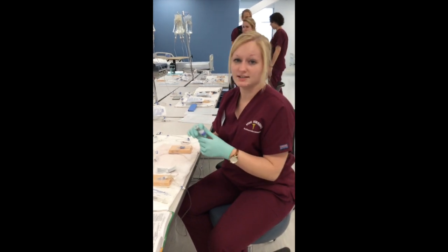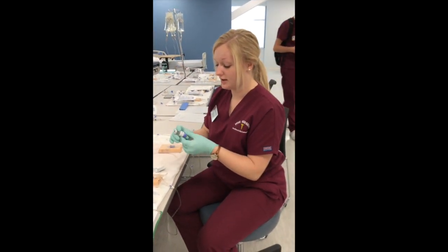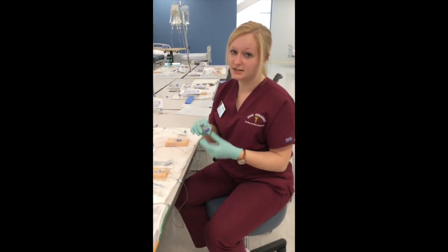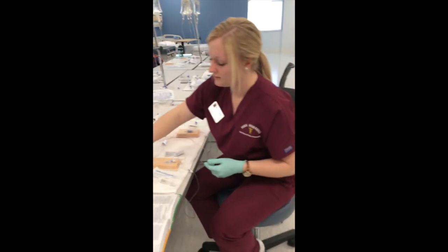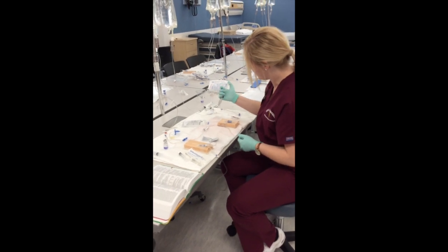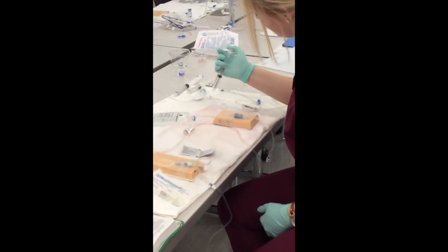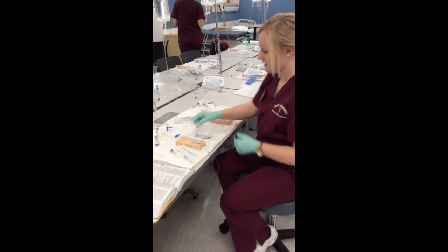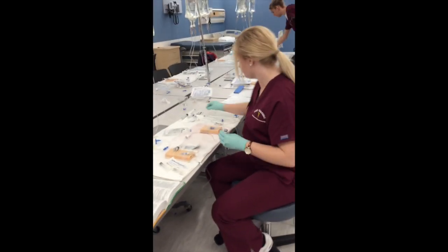I'm going to check all my 6 rights of medication administration. And I know I'm going to be drawing up 2 milligrams, and I noticed in my drug guide that it needs to be diluted, so I'm going to dilute it in 5 milliliters of normal saline. So I'm going to go ahead and get just 5 in there. Okay, so that is ready. And then I am going to get ready to draw up my medication.